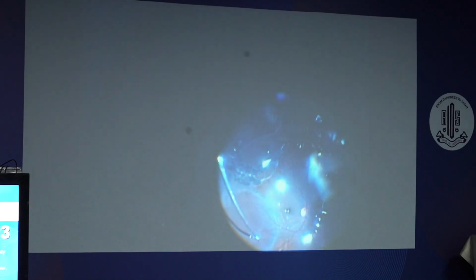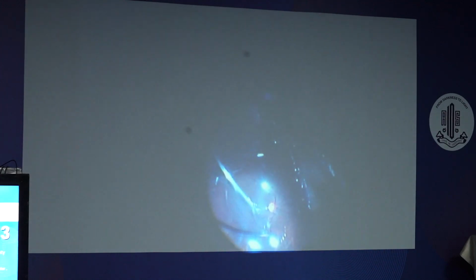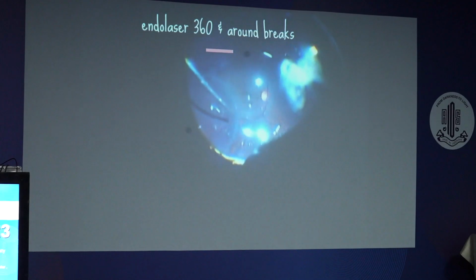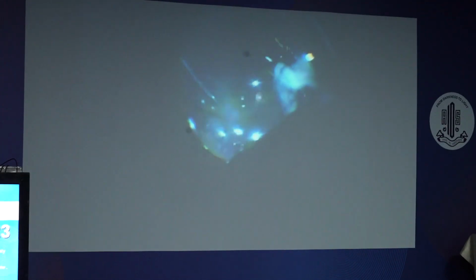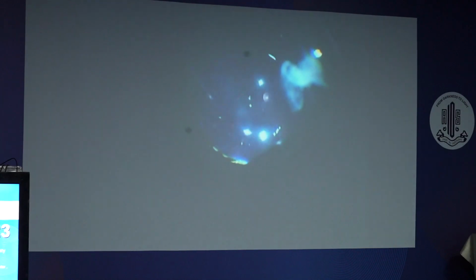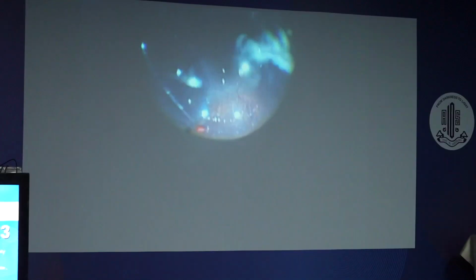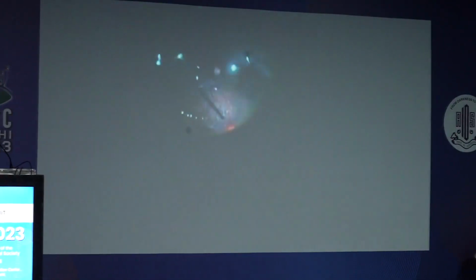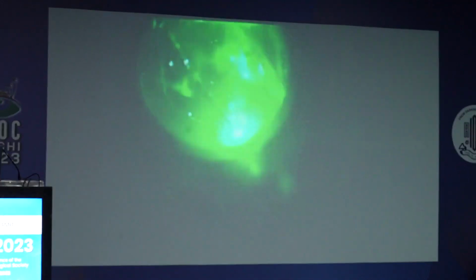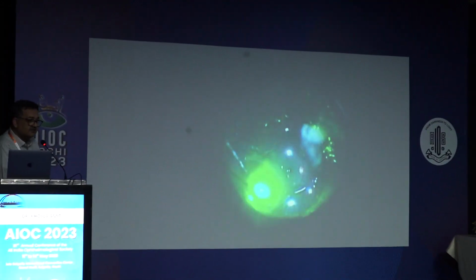Could it be retinoschisis with two breaks in an outer layer? Lasered that area, created extensive laser along the whole retinal detachment because there was no definite other break. Put oil. Now the patient after 3 months got a cataract surgery done and an oil removal. That patient has 6/6 vision.